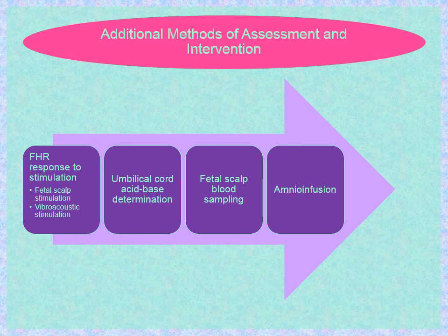Amnioinfusion may be performed. This is done when an isotonic room temperature fluid, usually lactated Ringer's or normal saline, is infused through the uterine pressure catheter into the uterine cavity if the volume of amniotic fluid is low. This can help in alleviating cord compression.